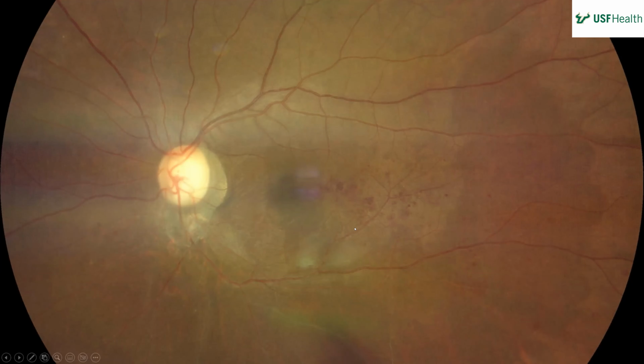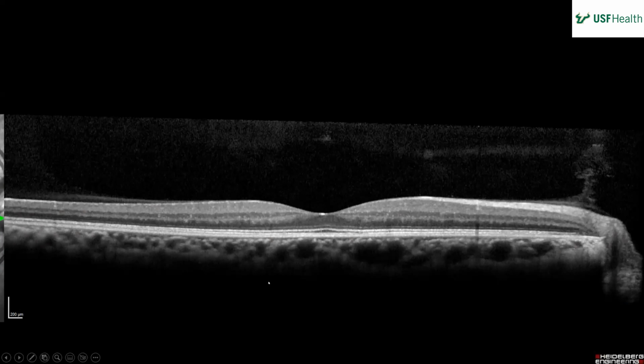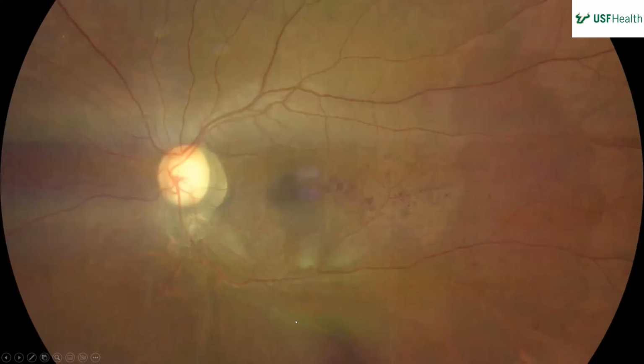What do you think about the vessels on the bottom of the screen? There's that bottom vessel coming over toward the macula, and then the vessel going inferiorly from that, on the very bottom of the screen. Can you see those on your screen? Oh, okay. So maybe some sclerotic vessels or ghost vessels there. Those look kind of ghosty to me.